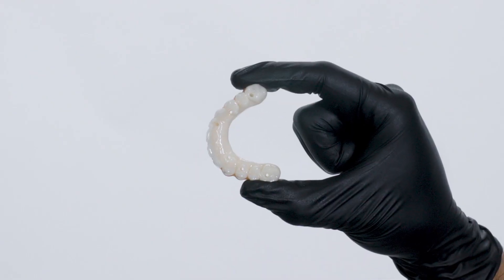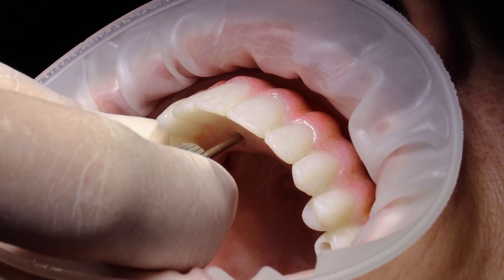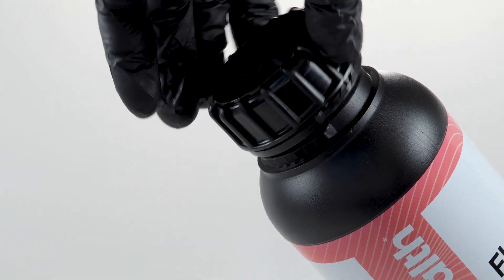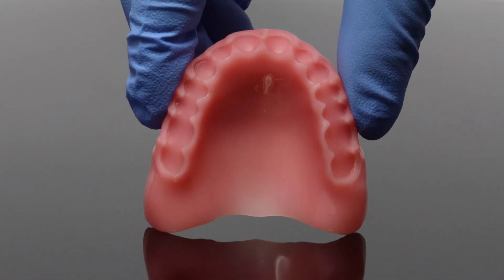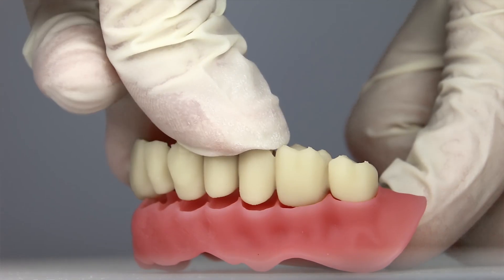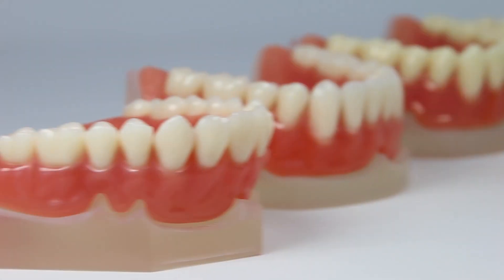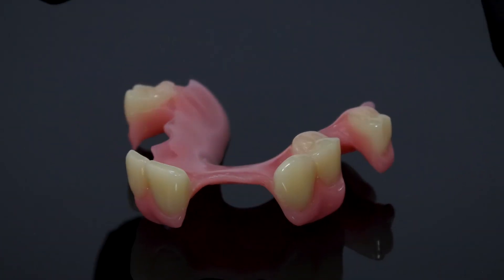With that material, we started noticing that the strength was at the next level. With the new base material, we noticed the shade was closer to the industry standard that doctors are accustomed to. And since we're able to make it a little bit thinner, we're able to see our designs go from a full denture all the way to a one-tooth to a three-tooth stay plate.